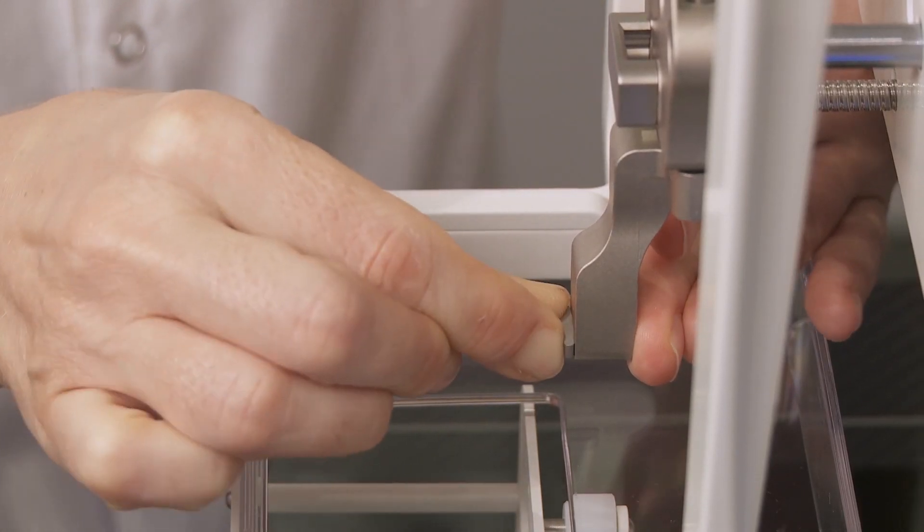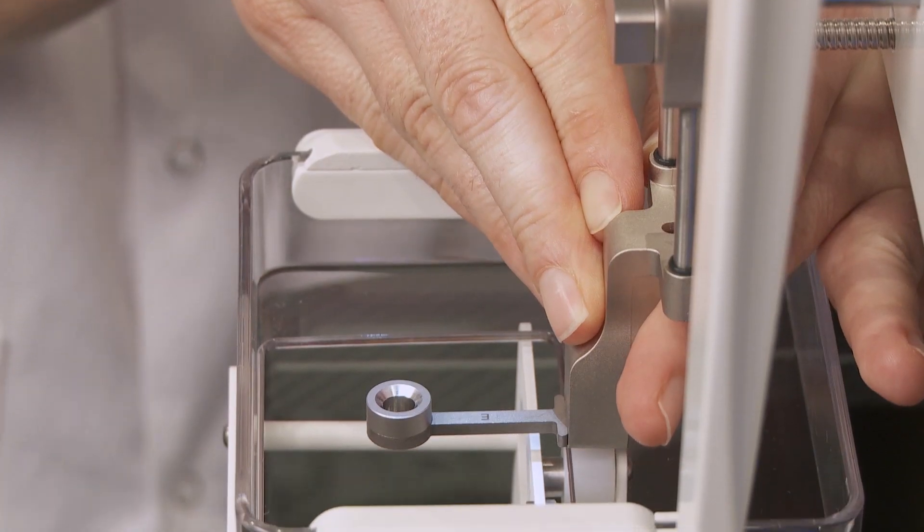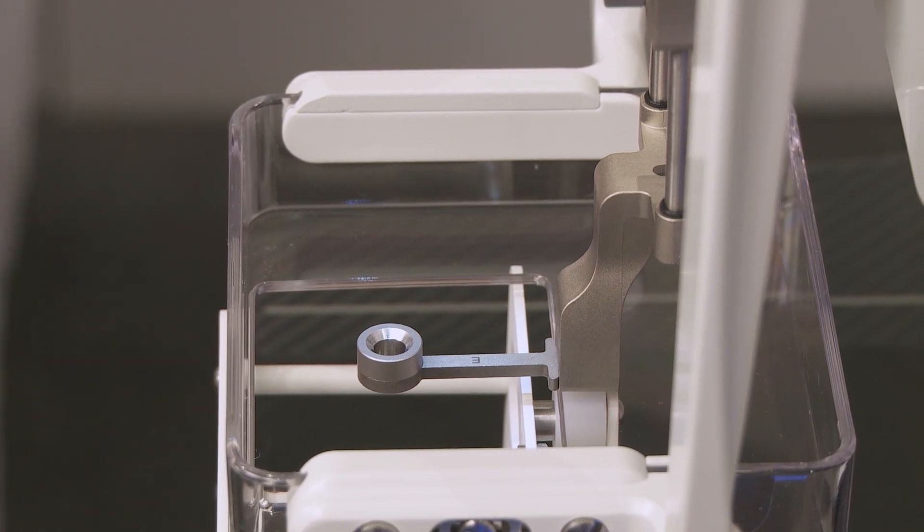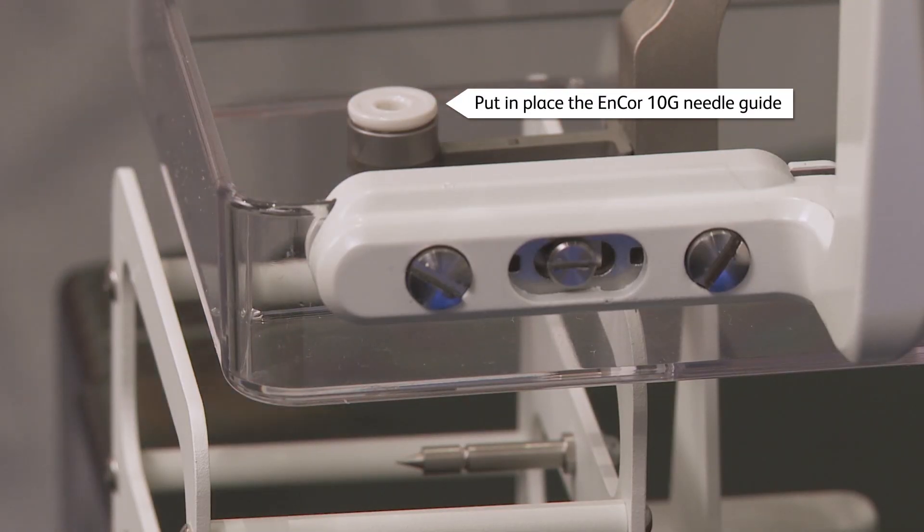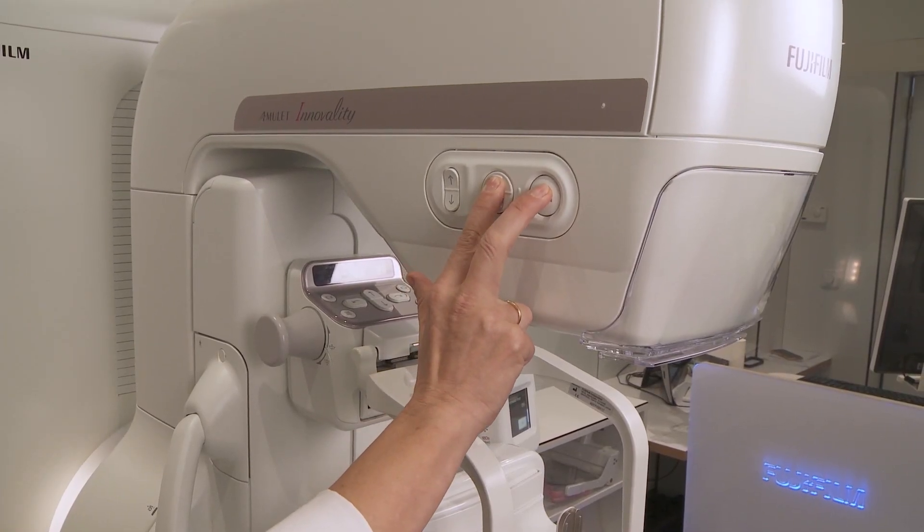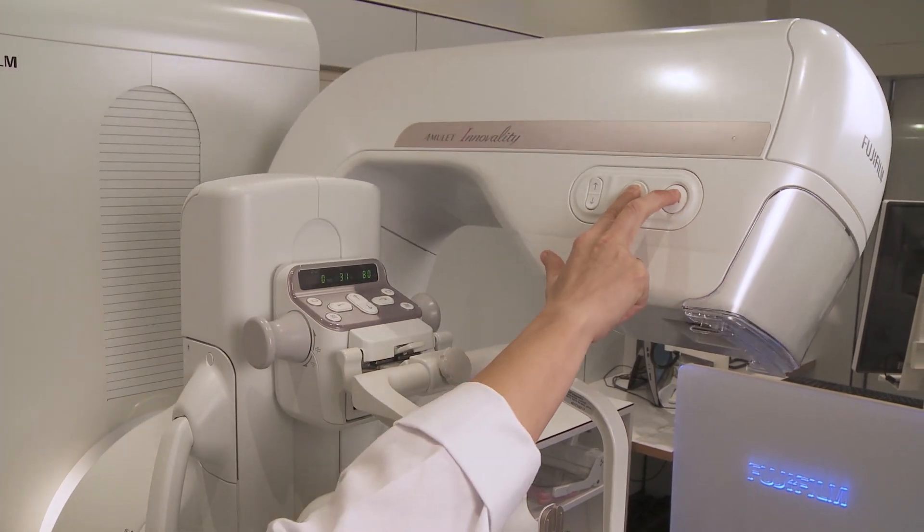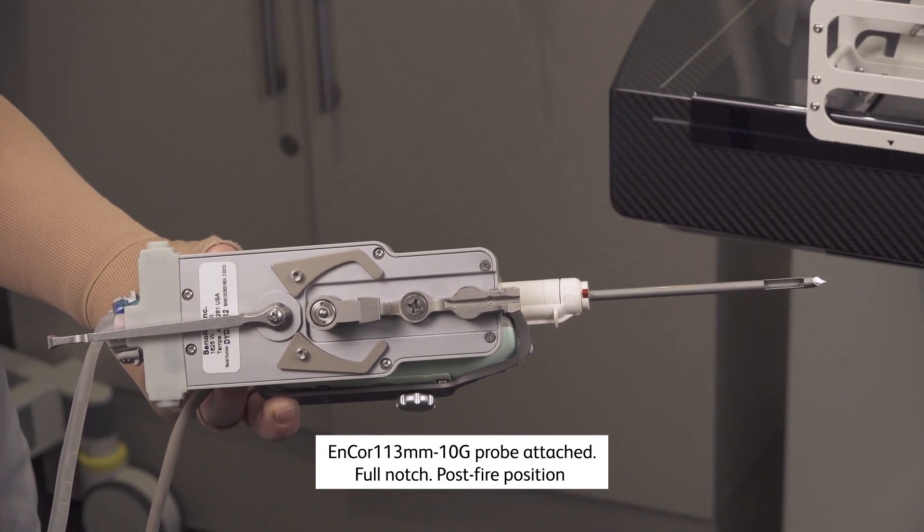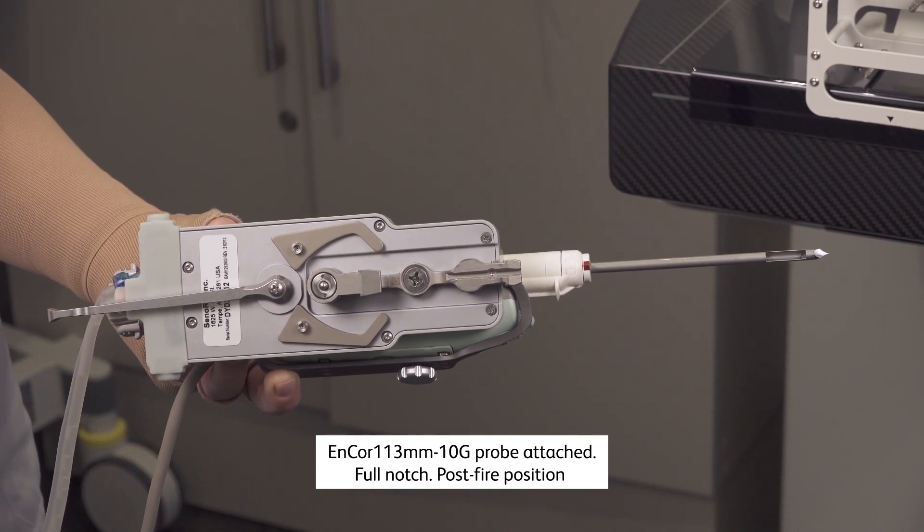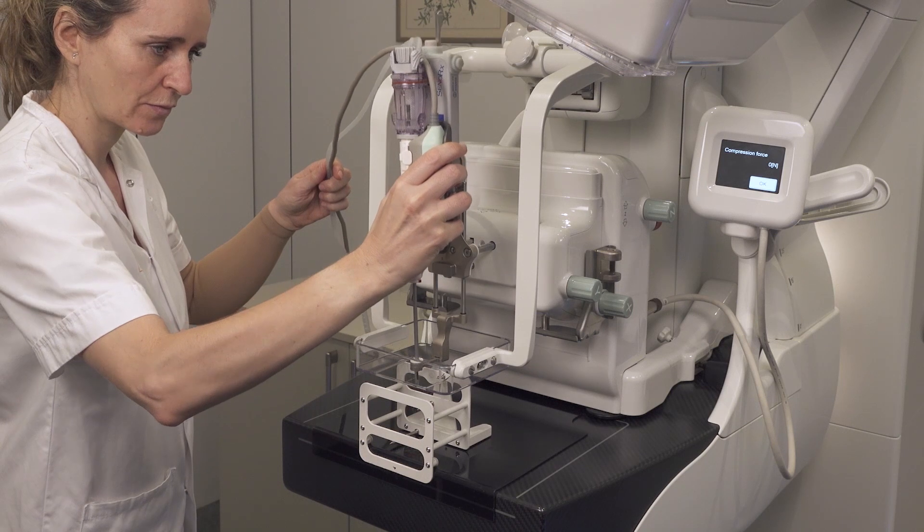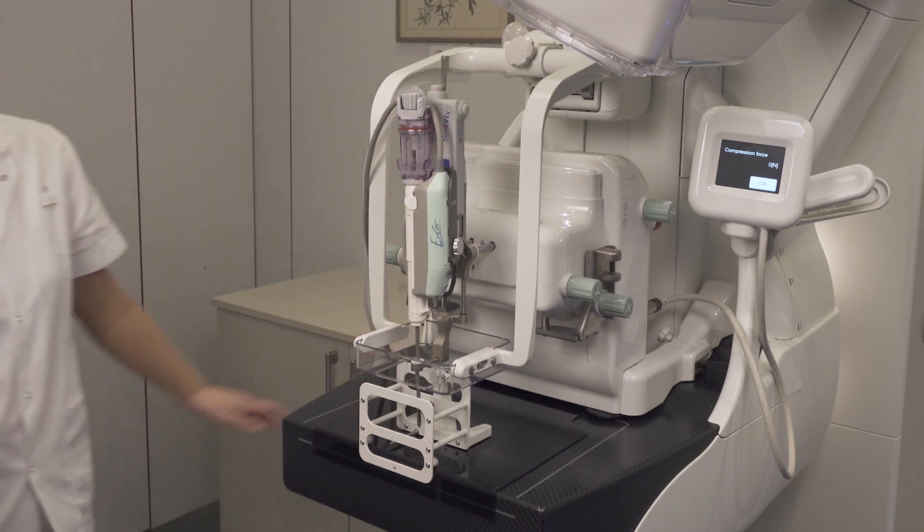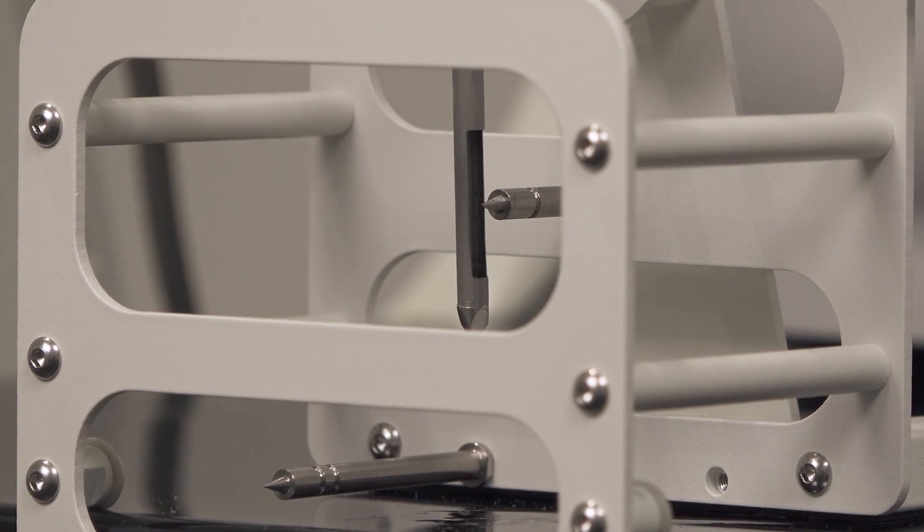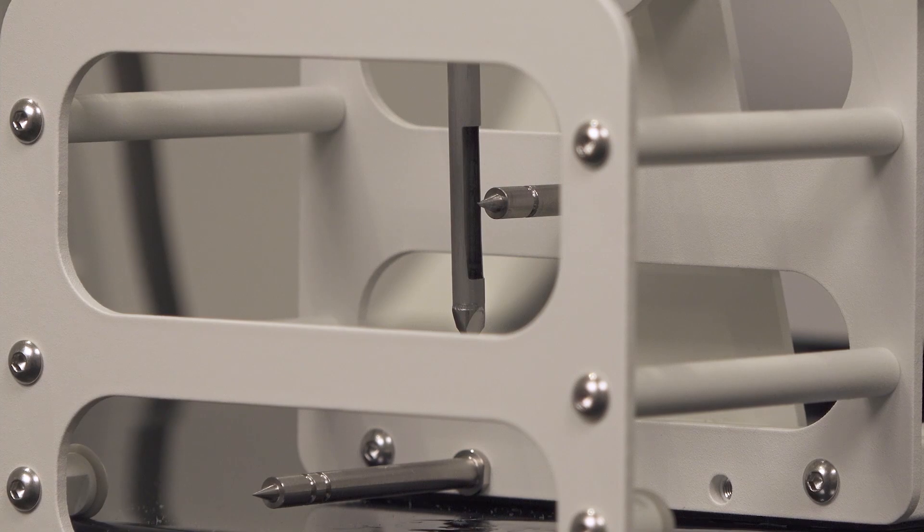Attach the Fuji Dedicated Needle Guide Holder for Encore. Lower the needle holder. Angulate the tube to free space for needle insertion. Insert the probe. The tip of the selected target should be about in the middle of the notch.